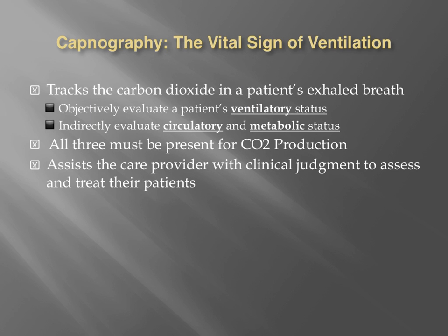First off, the most important slide with the most important words. Capnography, the vital sign of ventilation. With capnography, we're tracking the carbon dioxide in the patient's exhaled breath. We're objectively evaluating the patient's ventilatory status, and we're indirectly evaluating the circulatory and metabolic status. All three, I repeat, all three must be present for carbon dioxide production.